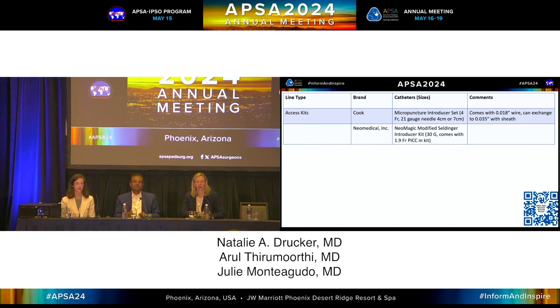You really didn't go over the common facial vein cut down, and that has been my standard for the babies that are 500 to 550 grams, because there's no subcutaneous fat. The anatomy is so consistent. And I don't have data on this, but the one thing that bothers me about ligating the IJ or causing IJ obstruction in these infants is the concern of elevating cerebral venous pressure and contributing to intracranial bleeding. And these kids are so fragile, and it's just another consideration.